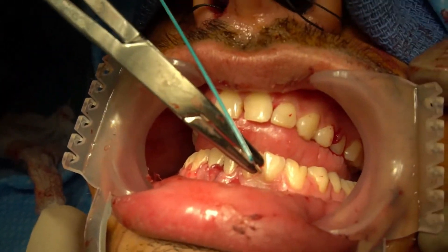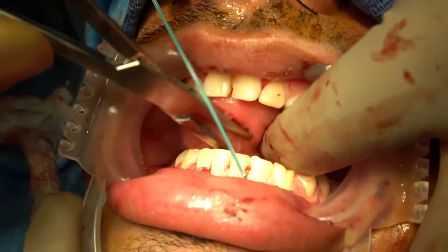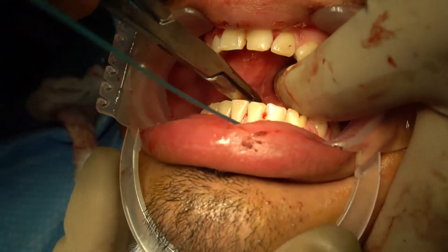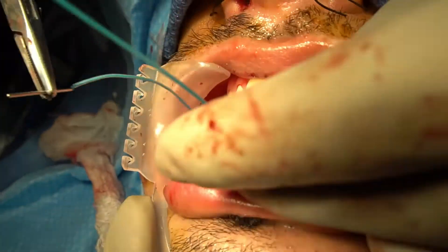To begin, insert the blunt-tipped stainless steel introducer into the embrasure by either piercing the gingiva or by displacing the papilla. After entering the mandibular embrasure from buccal to lingual, cross laterally behind the teeth and exit through another mandibular embrasure, typically two to three spaces from the first.